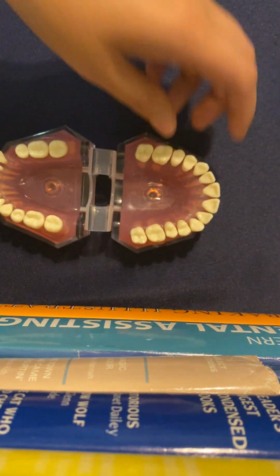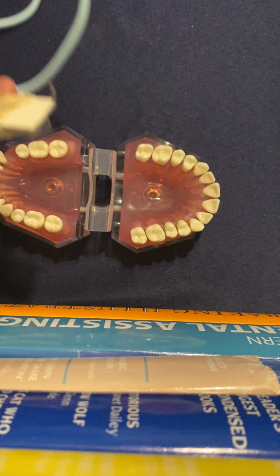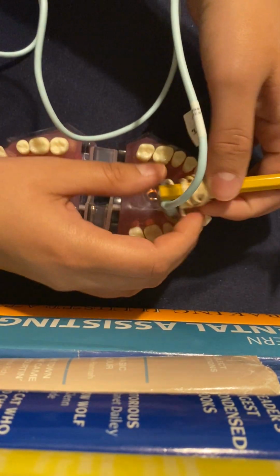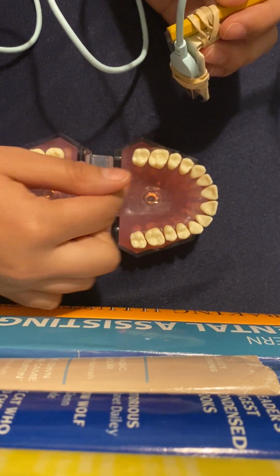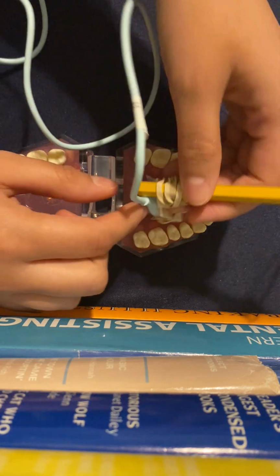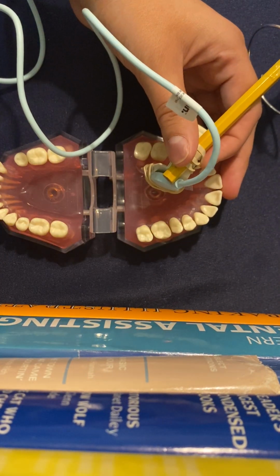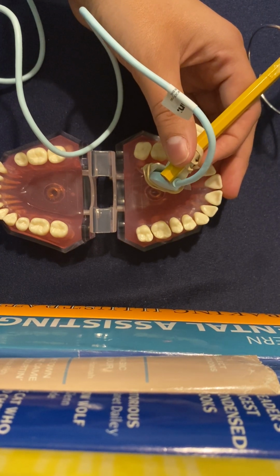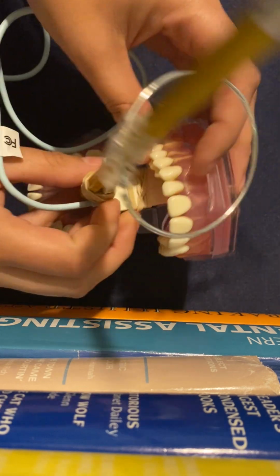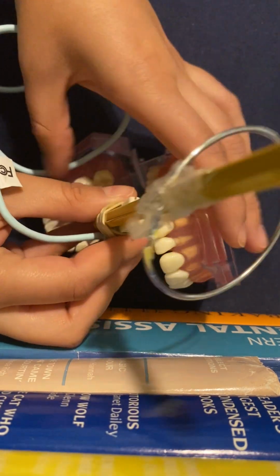Number 1, you're going to get your anterior bite tab, and you're going to want it at the midline, and you're going to kind of want to get inside. You don't want to get around the gums, but you don't want to gag your patient, so you're going to try to find that sweet spot. So number 1 is the maxillary right canine lateral incisor. That's quite a mouthful. So you're going to want to line up with that tooth right here.